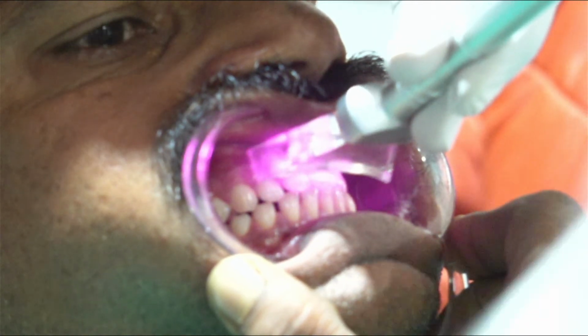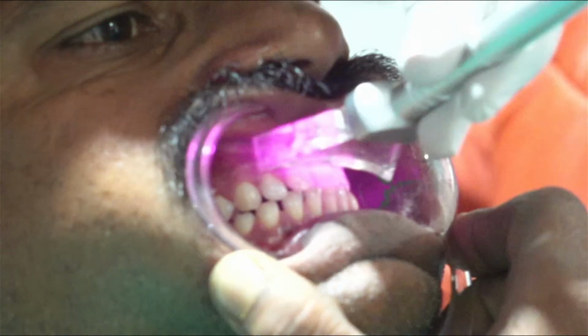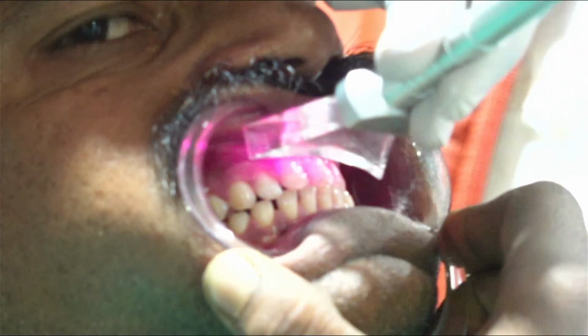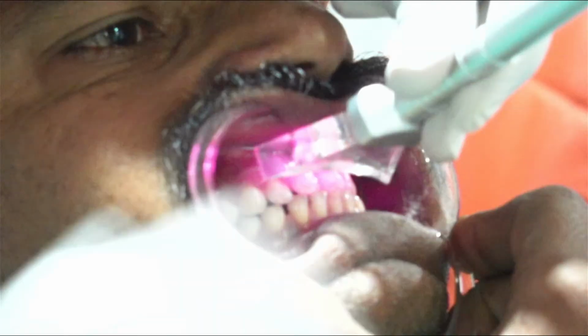We can do this as patient motivation and education also. Do it for one, he will feel the difference, he will come back again. But don't do it anterior. This patient has even distribution. He doesn't have much stains. If you do that, it really needs discolored teeth. Otherwise the patient will not come for you. He'll come to have a verbal argument with you. These teeth are white, no problem in this.